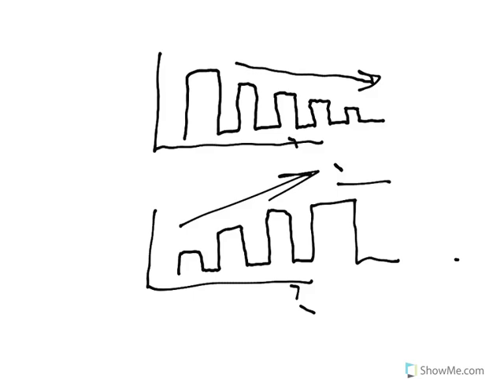I want to draw an arrow to point to that arrow. That's a really good arrow. Anyway, Bill's got an obsession with arrows this morning. You may see that in your cardiac arrest patients, this sort of pattern, as your patient is getting better. Now, patterns that you really don't want to see, besides that patient getting worse.